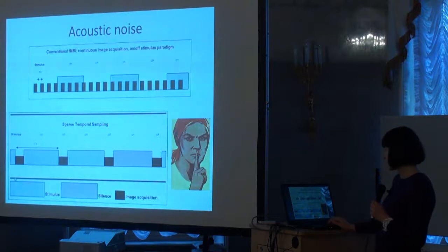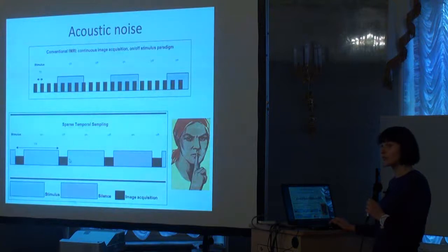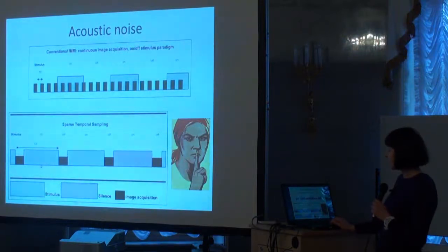So basically what we do then, we're presenting stimuli in a block, for example, several of them. Then there is no scanning. We do not collect data at that moment. This is the silent period.